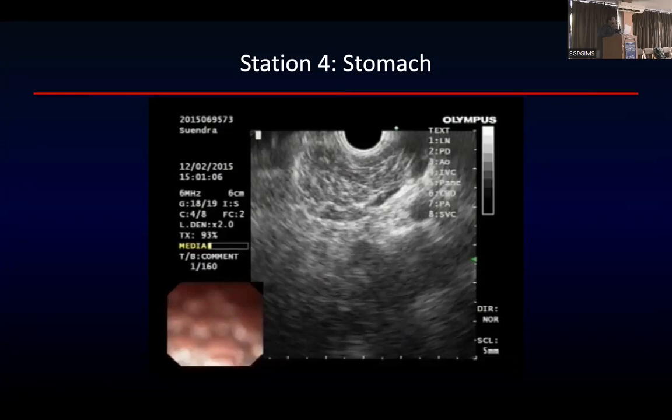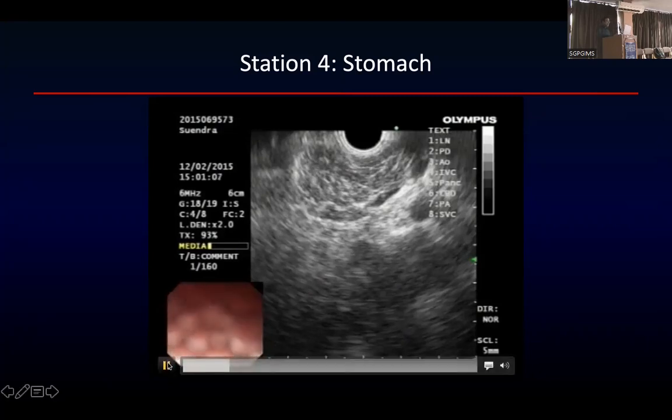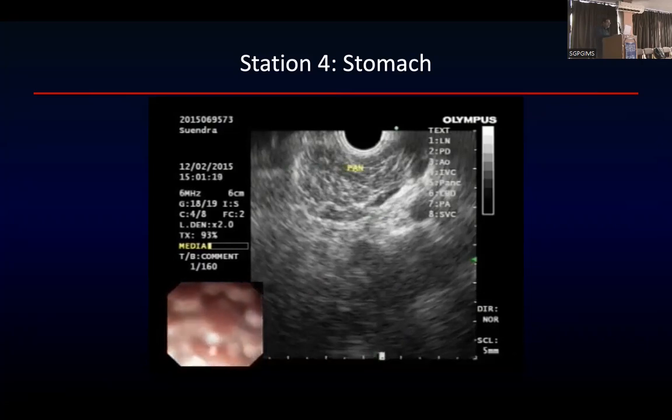Okay, what is a lobule? A lobule is a hypoechoic area bounded by hyperechoic areas or hyperechoic strands. So black in the middle, bounded by white, that is what a lobule is. If you look at this, this is the pancreas. As I mentioned, this is not a normal pancreas. If this patient does not have calcification, then definitely I would say he has established early chronic pancreatitis.